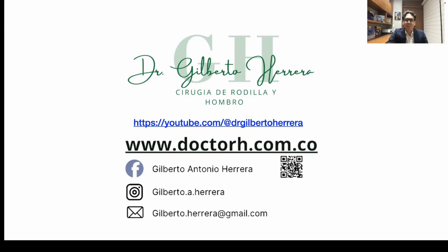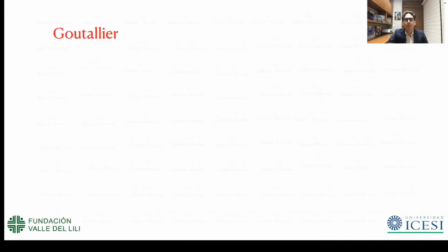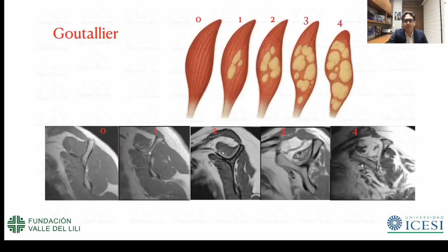All right, let's continue with our shoulder anatomy zone evaluation protocol. We've already covered positions 1 and 2. Now we're going to pause to assess the Goutallier classification. This classification is extremely important for shoulder surgeons, as we already know.